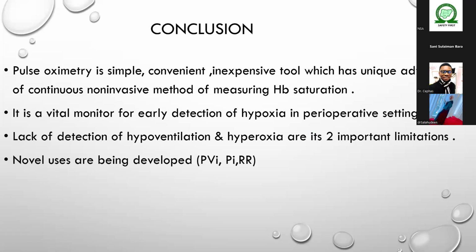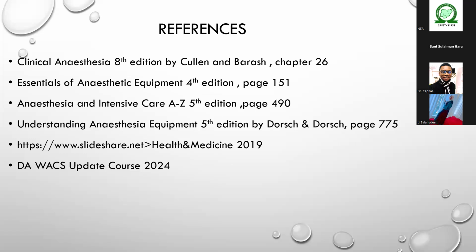It's not really my topic, so I didn't go too much into it, but since it's close to my conclusion, it's just an index for continuous, non-invasive, dynamic indication of fluid responsiveness in mechanically ventilated patients. So, like the pulse oximeter uses the cardiac cycle, this uses the respiratory cycle. These are my references.